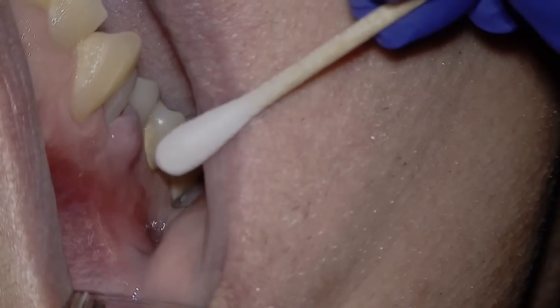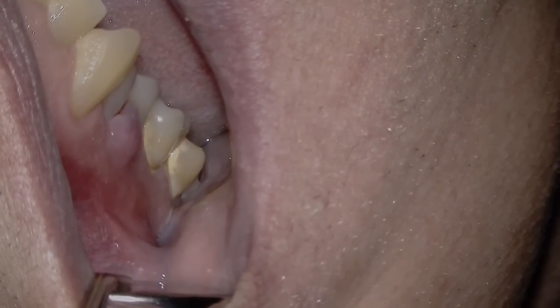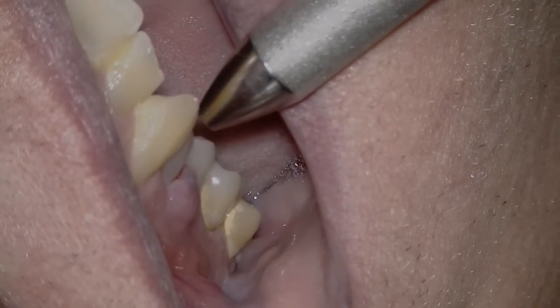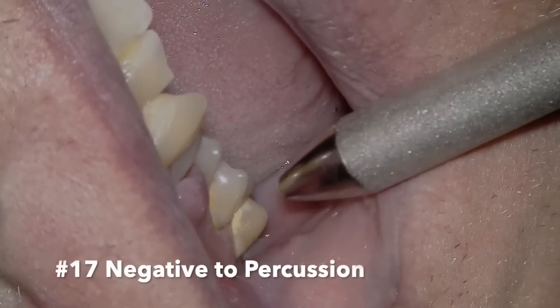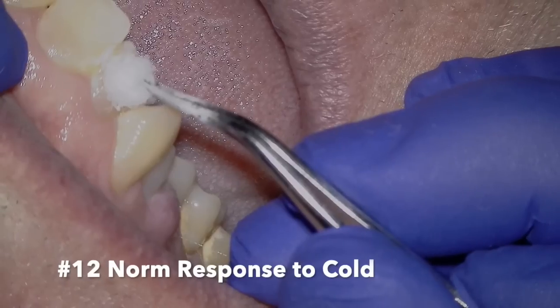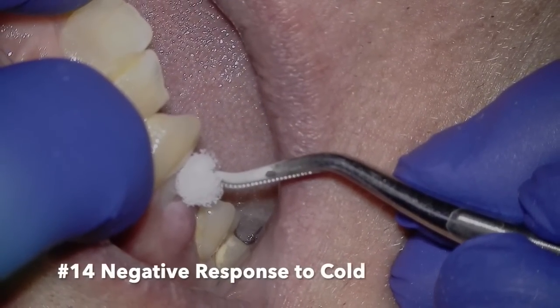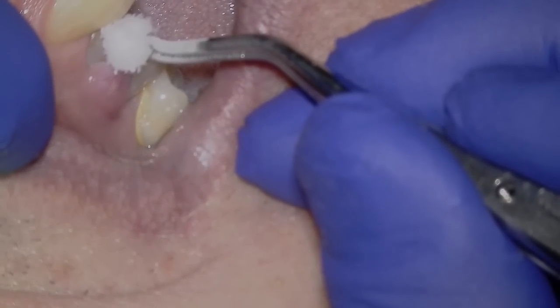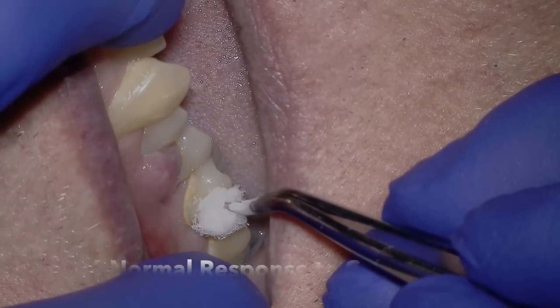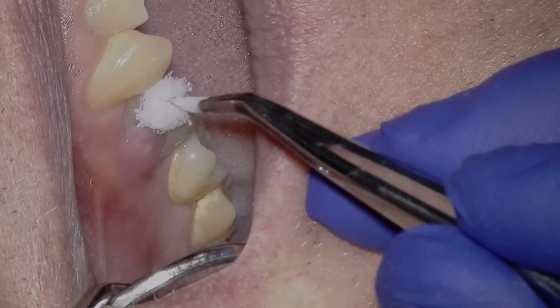This is a really simple way — I love it because it's super specific — using a cotton tip applicator to do your palpation. I'm just palpating right around on the buccal tissue. There was apical sensitivity. And here you're going to see the percussion test. Now we're going to go to the cold test. Teeth number 1-3 and 1-2 — the lateral and the canine — respond normally to cold. Tooth number 1-4 has turned out negative, and you can see the periapical radiolucency on the radiograph. I wanted to reconfirm and make sure it is necrotic. Tooth number 1-6, the first molar, gives a normal response. Just to make sure on 1-4 — because I wanted to confirm the diagnosis — if the tooth is cold, we want to make sure it's super cold. And it came back necrotic.